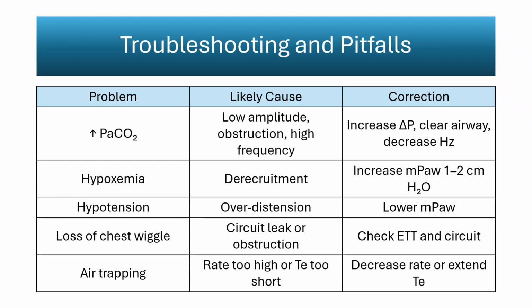A systematic approach: assess the patient first, verify the circuit, then adjust one variable at a time, ensures stability and maintains the lung protective intent of high-frequency ventilation.